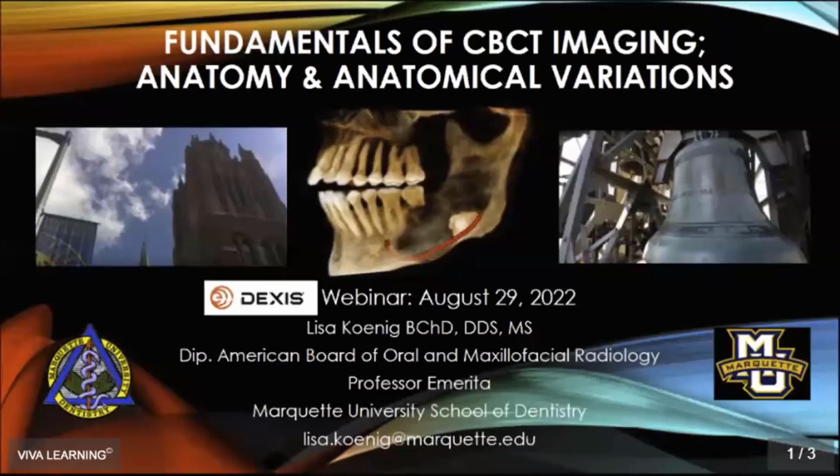There is absolutely no reason for you to be imaging the skull base or higher than that if all you need is the mandible for an implant. You should keep it to the area where you feel comfortable. And if you're not comfortable, then you need to find yourself a friendly oral maxillofacial radiologist who's going to be able to read your scan for you, because you are responsible. Which is why, if you are regularly doing large fields of view, it probably would be a good idea to have an oral maxillofacial radiologist read the scan for you.